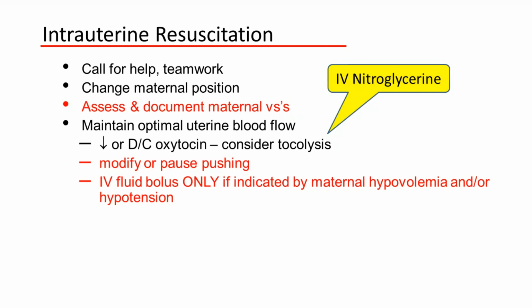But if you're using prostaglandins, from misoprostol to the others, you may want to consider IV nitroglycerin. It's always important to have a nitroglycerin kit or some information on how you give it, because it has to be given IV. What's really important in the second stage is that often there's an abnormal tracing, and you've probably all seen this, with prolonged deceleration or complicated variables, and everybody's yelling push, push, push. Just stop pushing for a couple of contractions, and it's remarkable how well the fetus can compensate. Remember that when a woman is pushing, intrauterine pressures are way more than 60. They can be 100 or so, and there's no perfusion unless there's some time for that fetus to resuscitate itself. So stopping pushing will often save the tracing and make it improve.